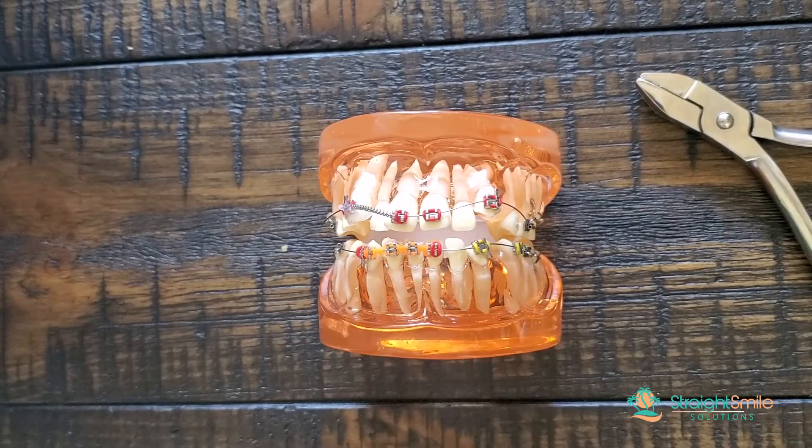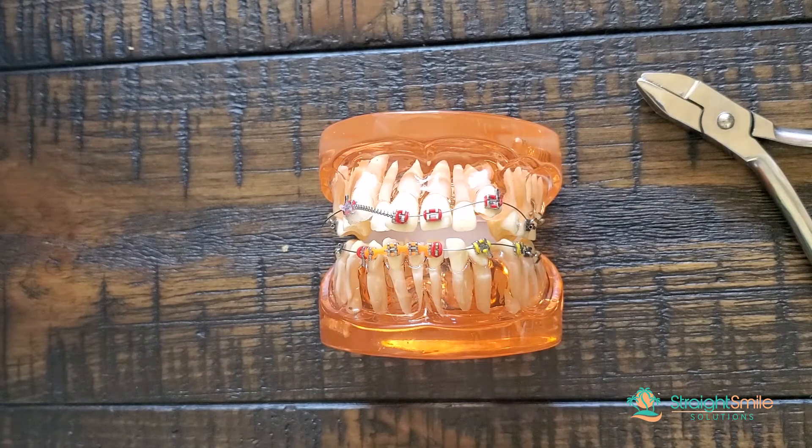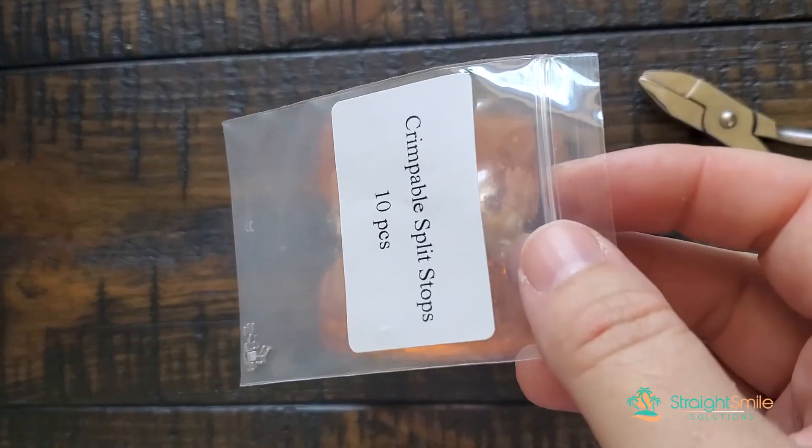Hi, this is Dr. Amanda with Straight Smile Solutions and today we're going to talk about reactivating your open coil springs. And this is one of the greatest hacks, which is a crimpable stop.